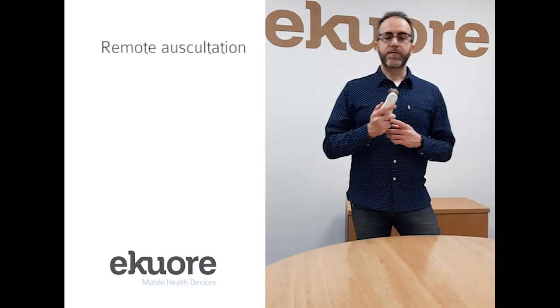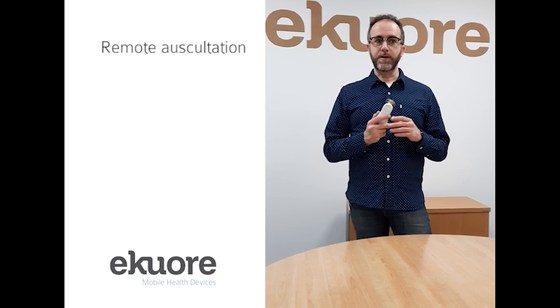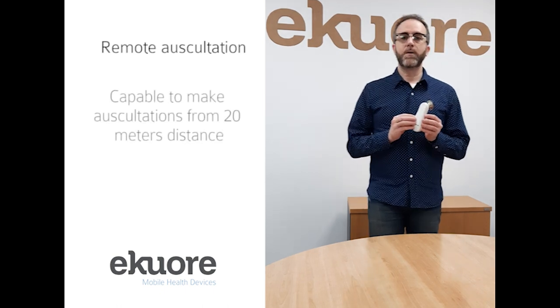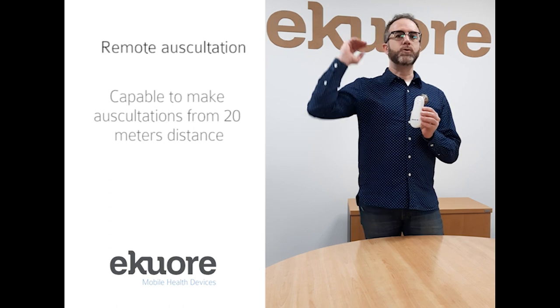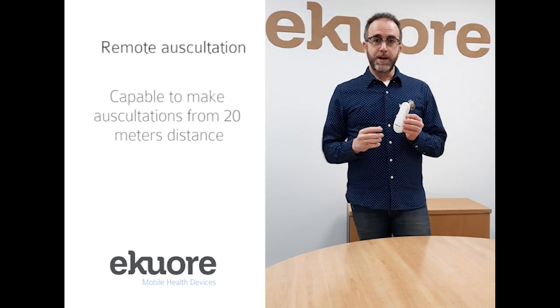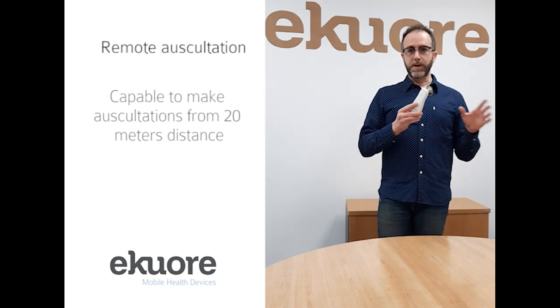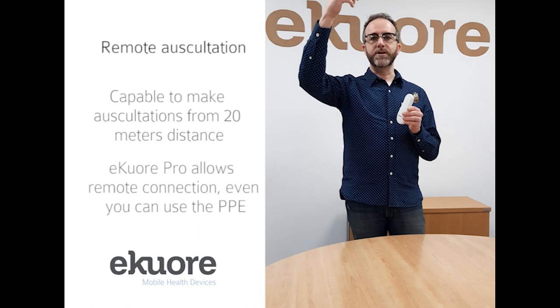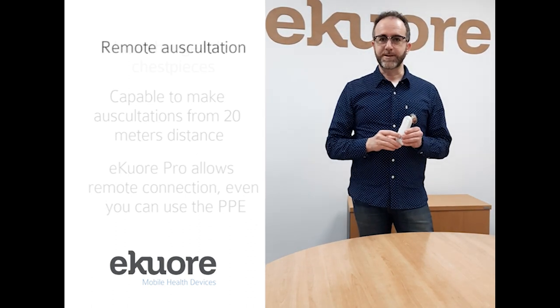One of the best features of our EqualPROD regarding COVID-19 risk of contagion is that you are capable of making the auscultation from up to 20 meters distance. This is the option of being 20 meters away — you can even auscultate a patient from an isolated room up to 20 meters distance.